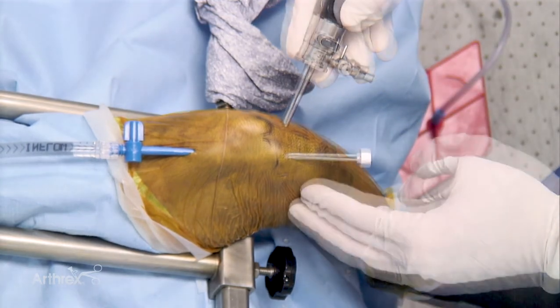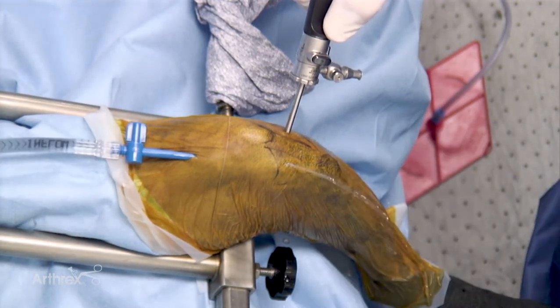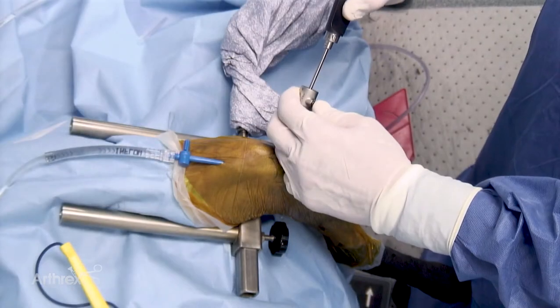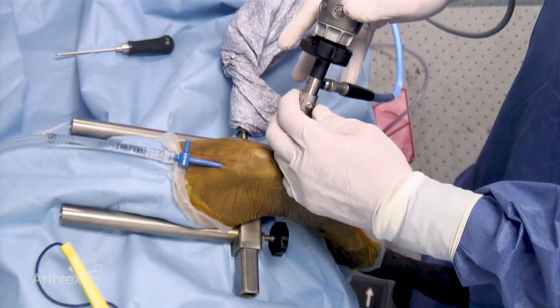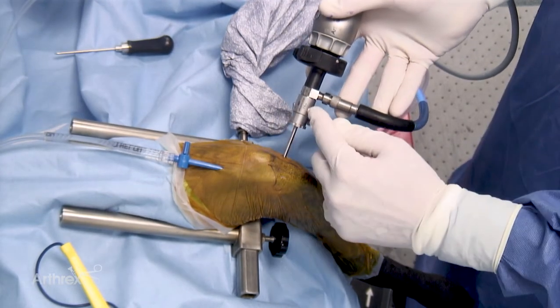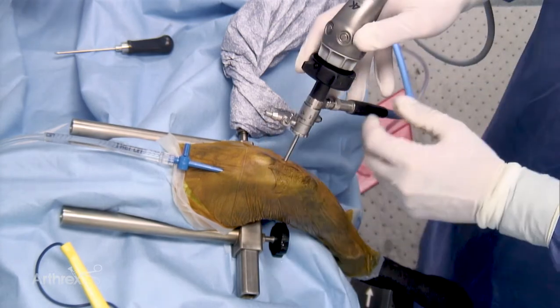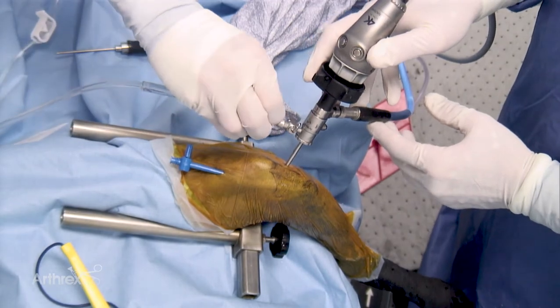Placing the scope cannula and obturator into the joint is now performed. Removing the obturator from the cannula flow and decreasing the fluid flow is the next step. The obturator is removed and the 2.7 short scope is placed. The light post must engage the cannula, and the light post should be in equal position and in the same orientation as the depression button on the cannula. Once this is locked in position, the fluid line can be detached from the cannula flow and placed onto the arthroscope fluid line.